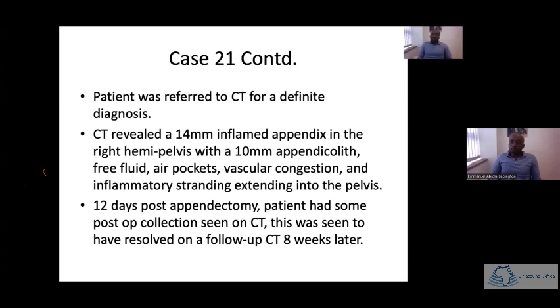This patient would have benefited a lot from a transvaginal ultrasound, because we most likely would have been able to see the end of the appendix, from that part of the appendix in the pelvis, to confirm an inflamed appendix, and they wouldn't have needed the CT scan. However, the CT scan was done and the patient had an appendectomy almost immediately. Twelve days after the appendectomy, the patient had some post-op collection, so they were sent for another CT scan. Then 8 weeks later, they had another CT scan, which showed the post-op collection and complication had all resolved.